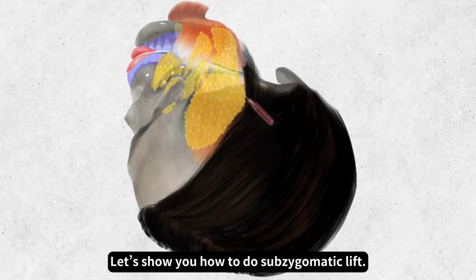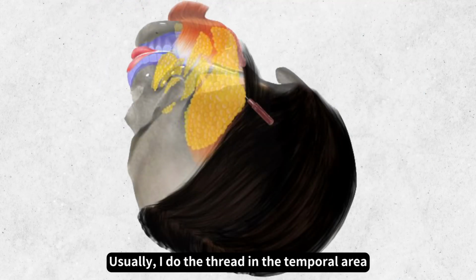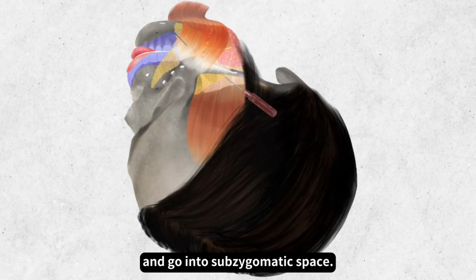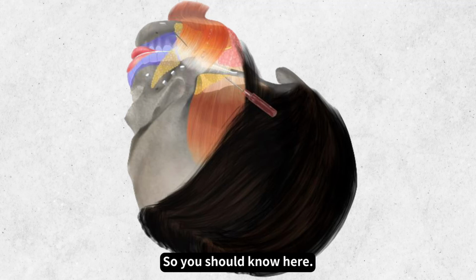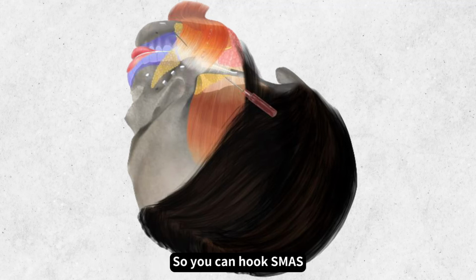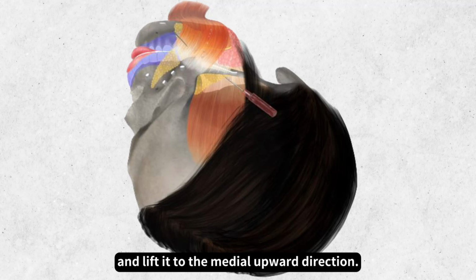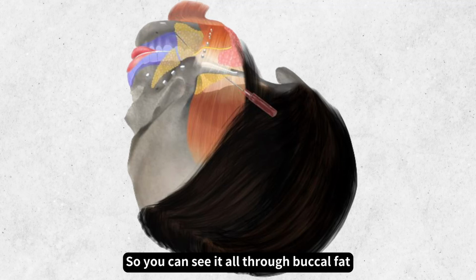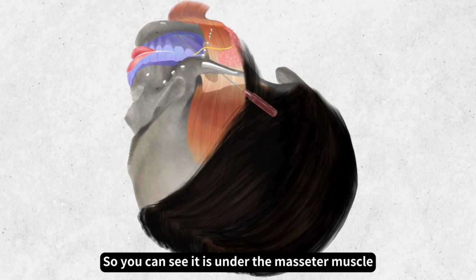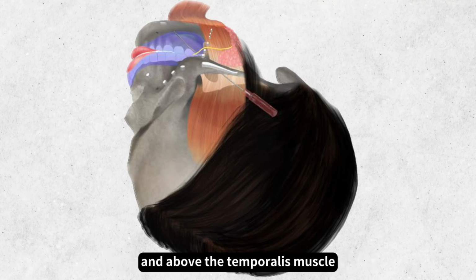Let me show you how to do the subzygomatic lift. Usually I do the straight in the temple area near the hairline and go into the zygomatic space. You should know that your trocar should go out from the inside of the platysma, inside of the SMAS, so you can hook the SMAS and lift it in the medial upward direction. You can see it goes through the buccal fat, and you should avoid going into the oral space. You can see it is under the masseter muscle and above the temporalis muscle, between the two muscle spaces.